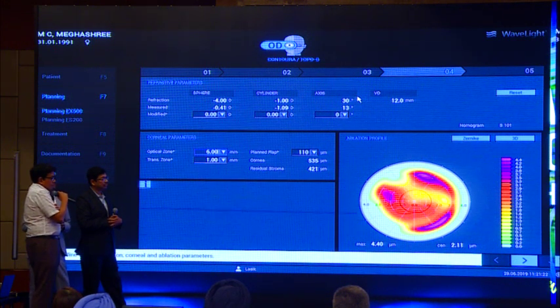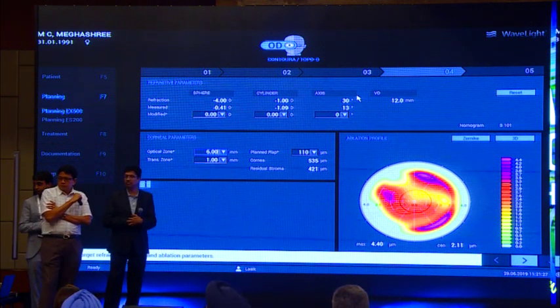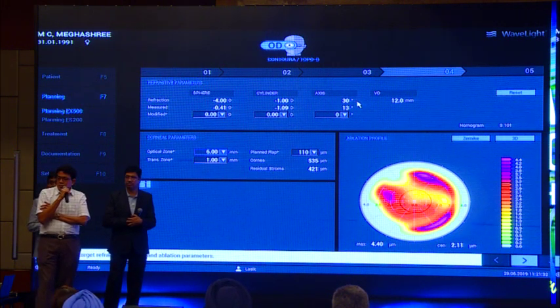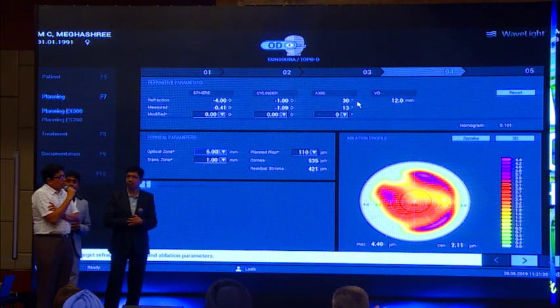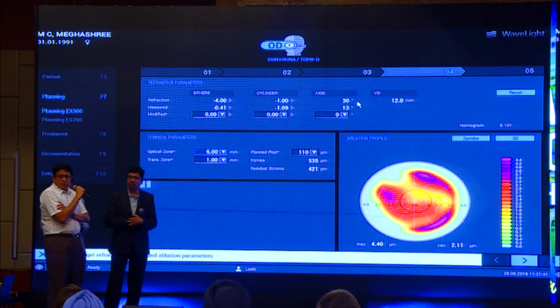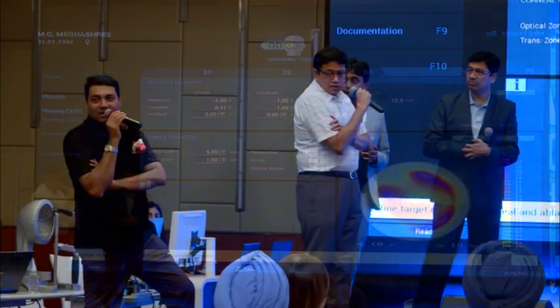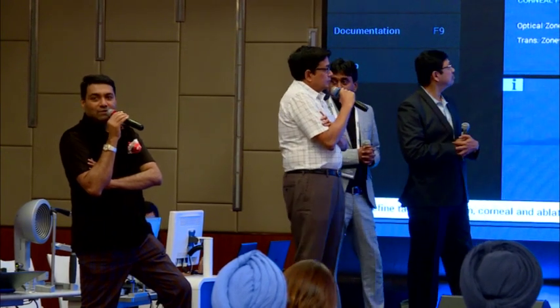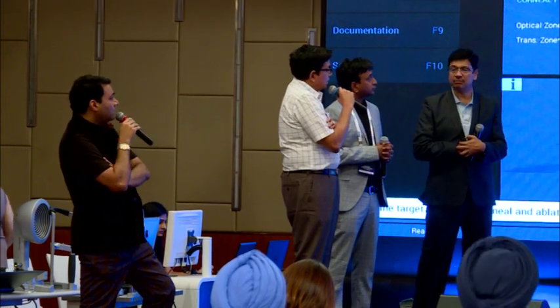Anybody else here? Sir, I would also go by the 13 degree axis only, topographic. Okay. Sir, can we see the topography of this patient? At this point, I don't think we have any other machine. Why do you all say 30 degrees then? Topography is perfectly healthy. There's no sign of any suspicion. I know why you are asking that. More than the topography, probably the Zernike pyramid would really help in this patient, because that is where... Can you see the Zernike polynomial for this patient? Go to Zernike polynomial there.